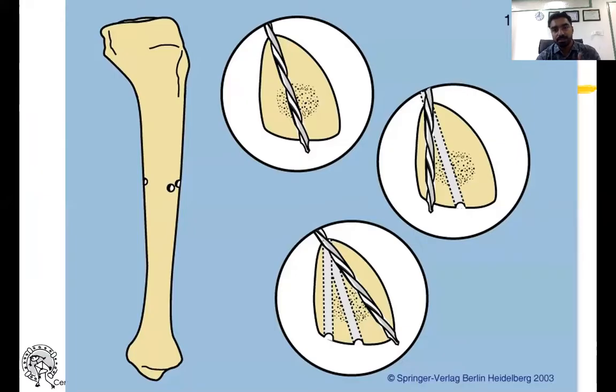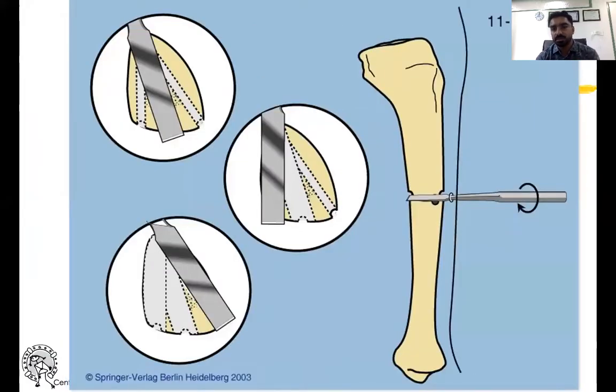You can appreciate antero-posterior and posterior directions. Then use an osteotome to just break the remaining cortices.